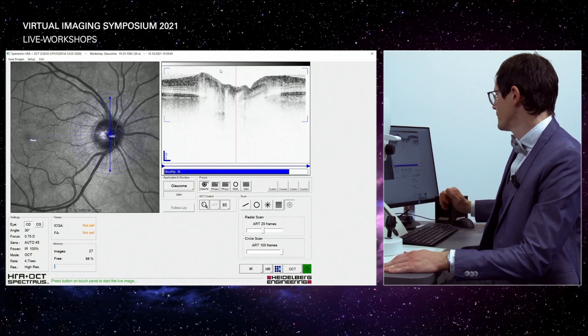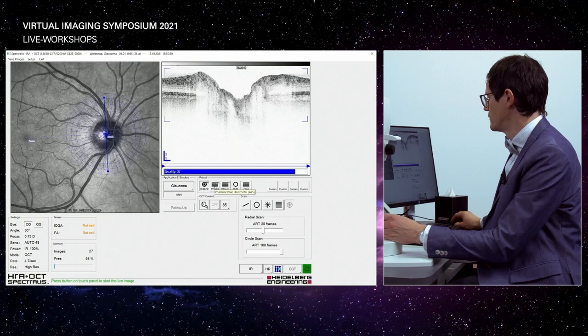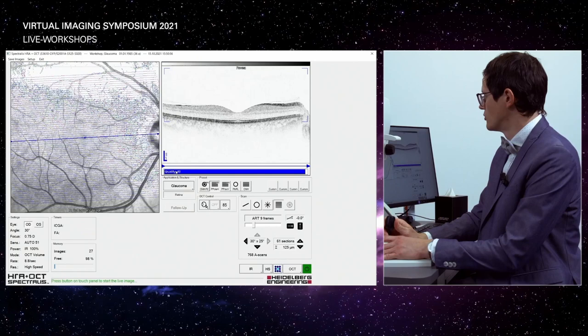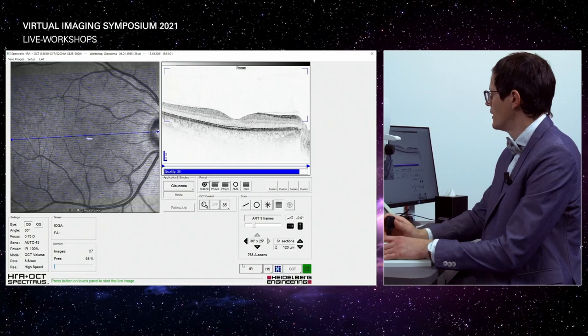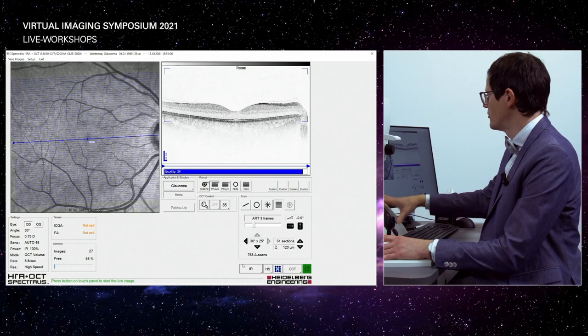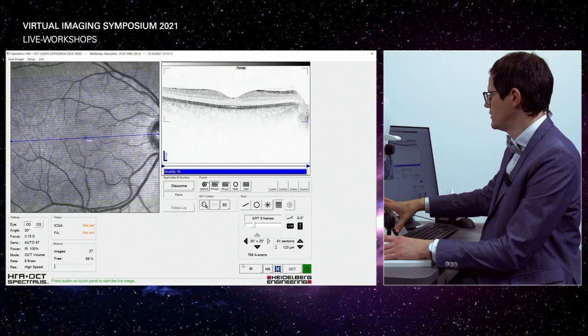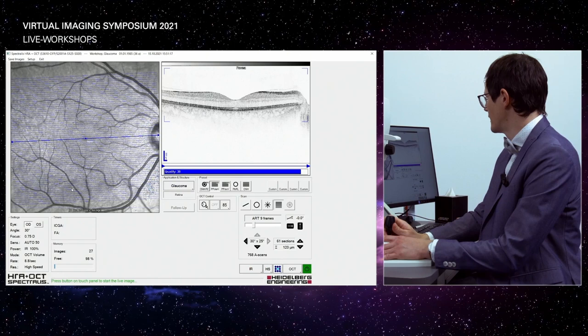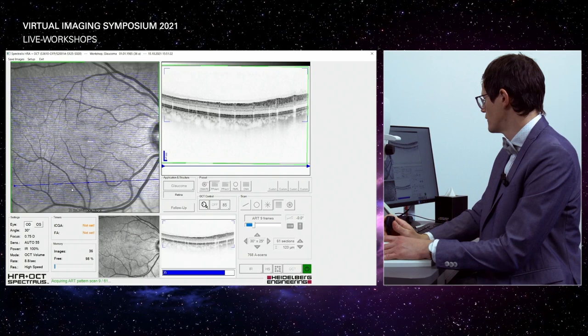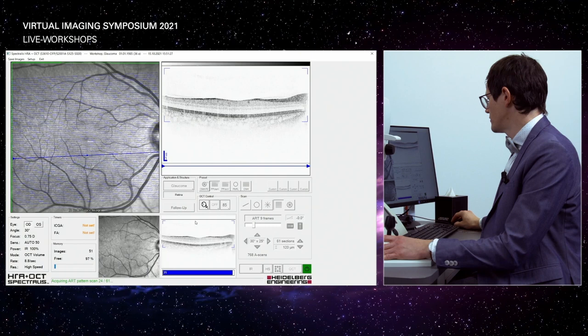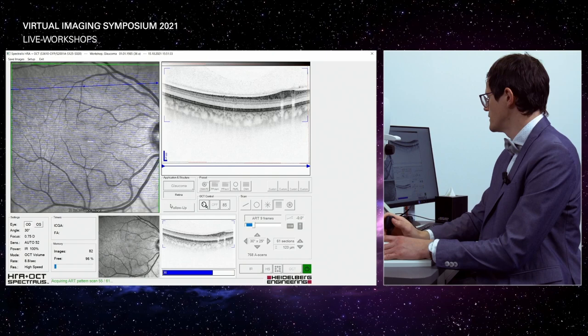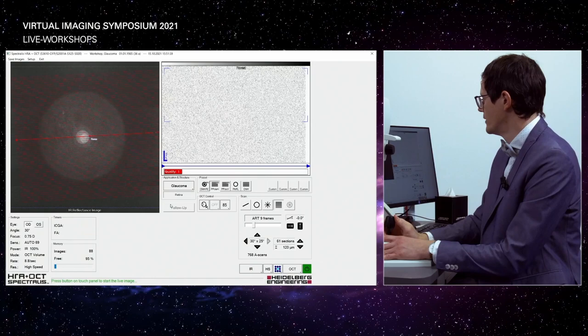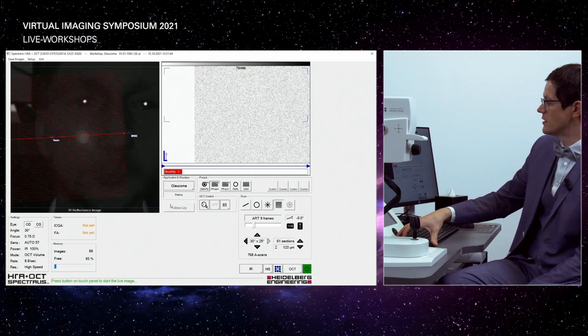The first scan is complete. As the next scan, we always recommend the posterior pole scan — horizontal. The fixation target moves back to center. In glaucoma we focus on the optic nerve head, but the posterior pole measurement allows us to compare the superior versus inferior part of the retina. We start eye tracking and begin acquisition, keeping the scan slightly below the top of the frame to ensure good quality. Once complete, we go back and check all measurements before proceeding to the other eye.